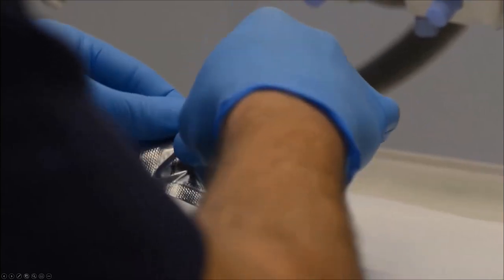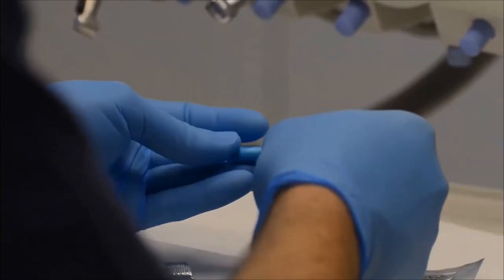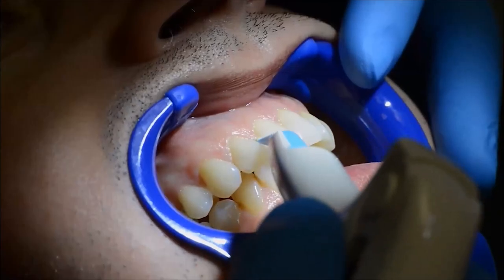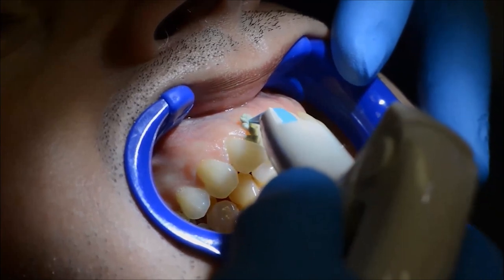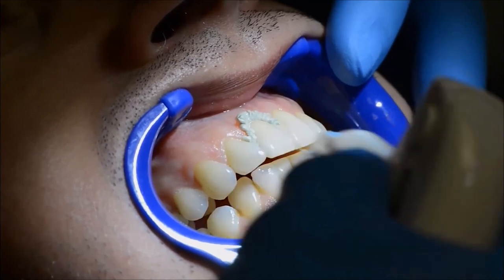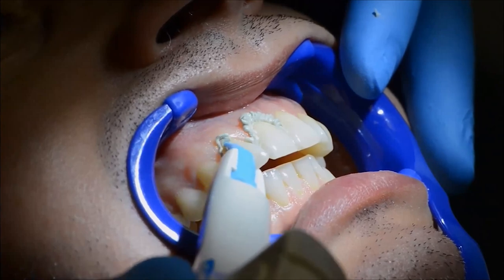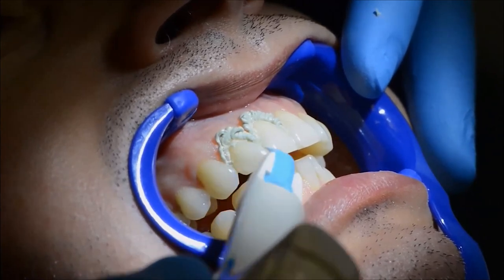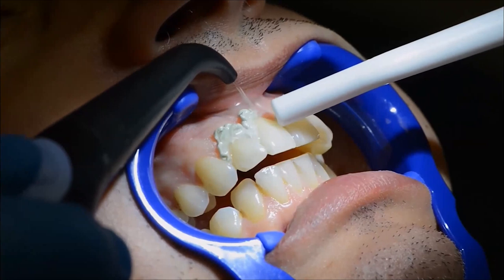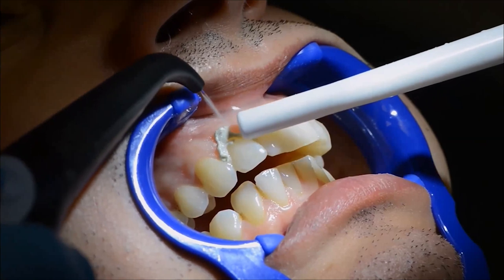This is Access Flow. As mentioned, it has the same chemistry as Access Edge, just a bit more fluid with a thinner tip. Here is a demonstration to give an idea of the material's consistency. As with Access Edge, apply the material, leave it in place for two to three minutes. If you have a preparation, you can also use a gingival cap. After two to three minutes, wash it really well, then perform the impression.